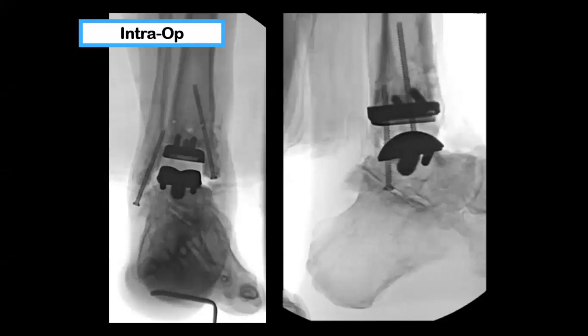So this x-ray here just shows my post-op intra-op films. This is that fibular screw, obviously didn't realize that it wasn't all the way in. So before we closed her up, we put that screw all the way in. This was one of my first ankle fusion takedowns. So the residents were... It is an Infinity. We use the Prophecy for it. I think it's actually an Inbone talar component and an Infinity tibial component.